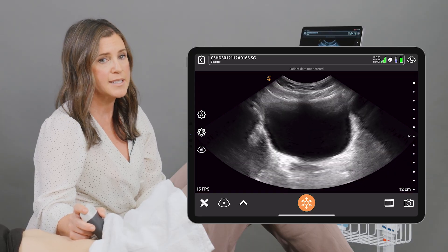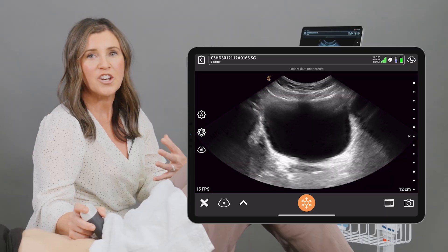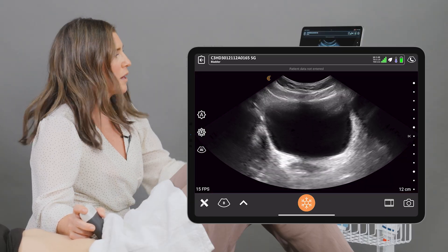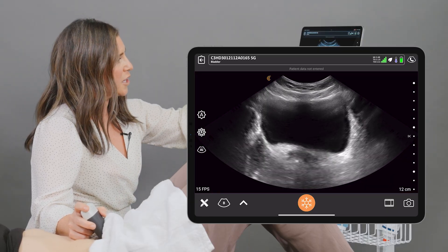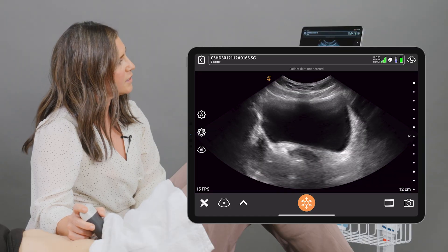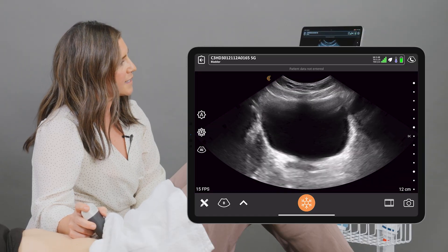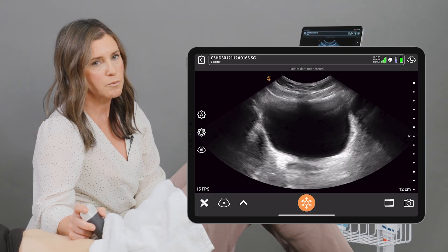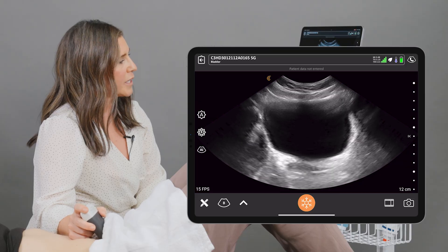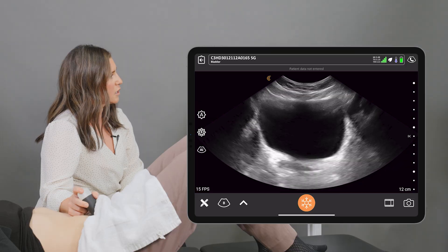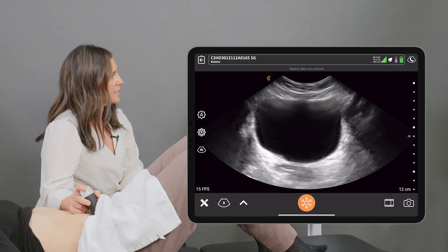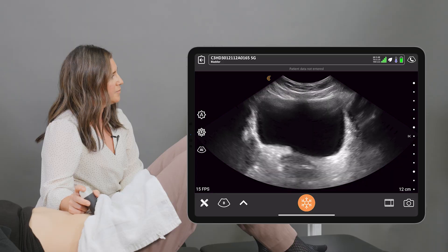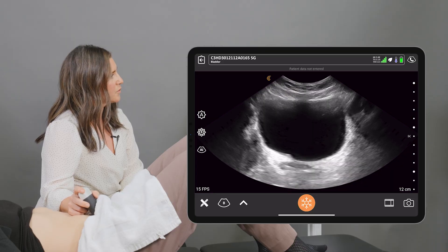Is the relaxation complete, partial, or not relaxing at all? We're seeing that bladder base lift, and in this case we're seeing a little bit more of the left side elevate more than the right, but we're getting a nice complete relaxation down. We'll do one more time and then letting it go.